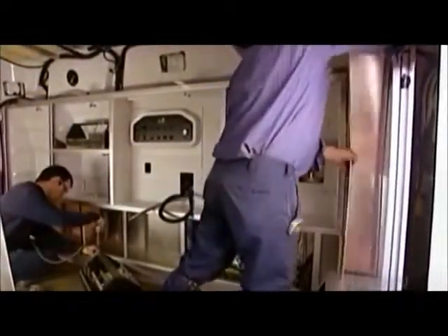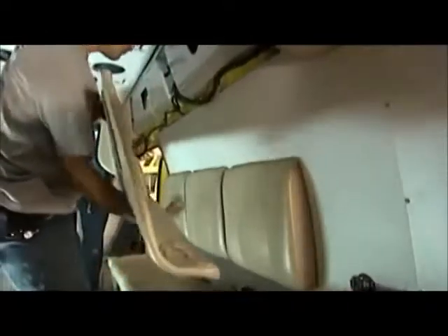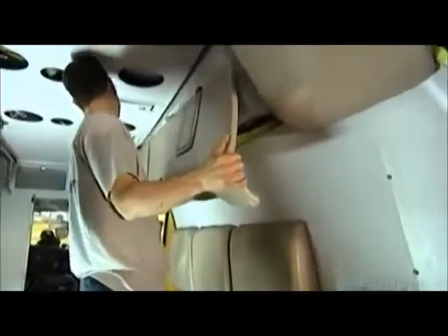A divider between the cab and the back gives the patient privacy. Vinyl-covered foam padding on the ceiling protects ambulance workers' heads when the vehicle jerks.